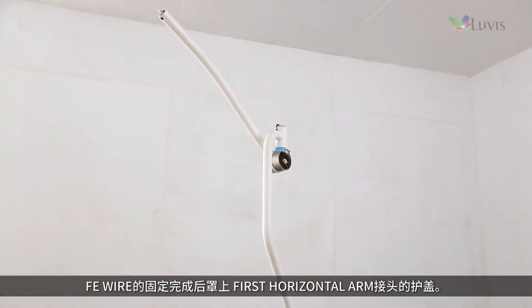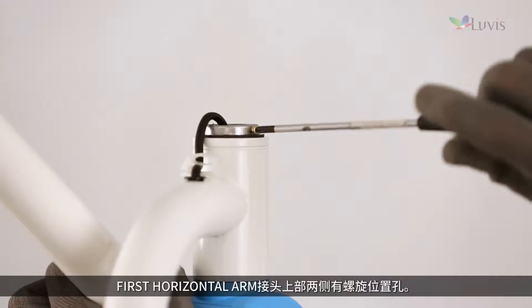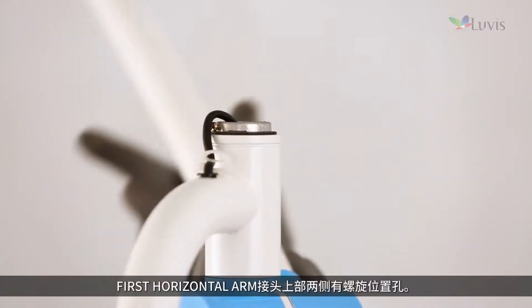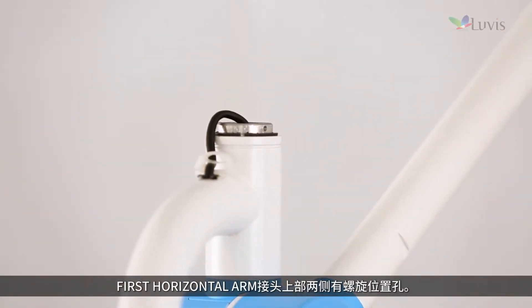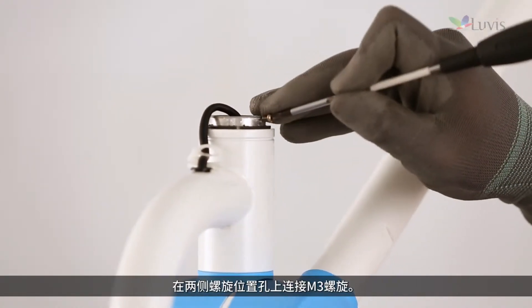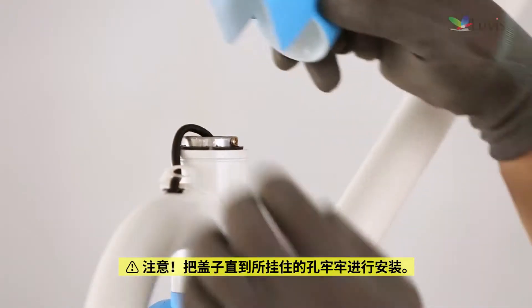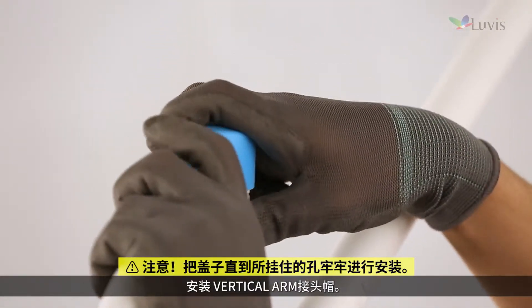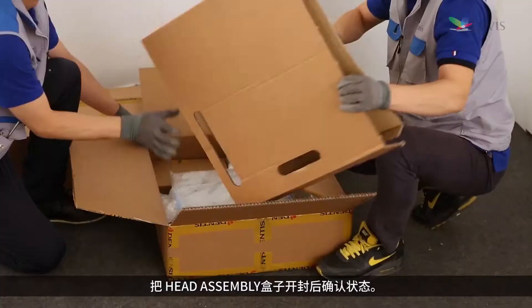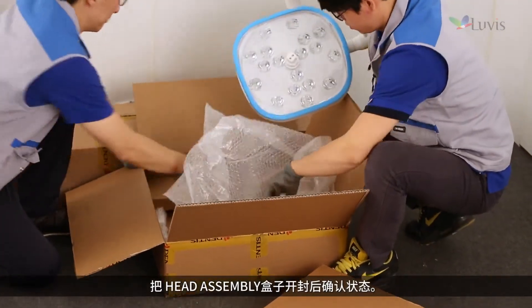After fixing the FE wire, put a joint cover over the first horizontal arm. There are screw docking holes on each side of the upper part of the first horizontal arm. Tighten the M3 screw into the screw docking hole on both sides. Install the vertical arm joint cap.